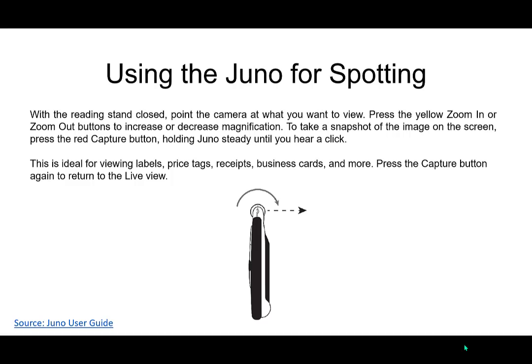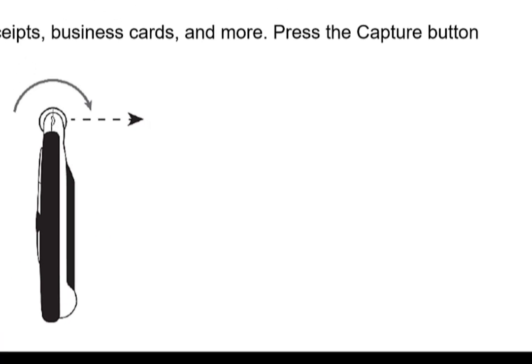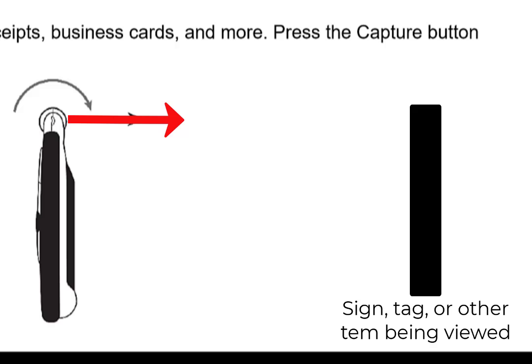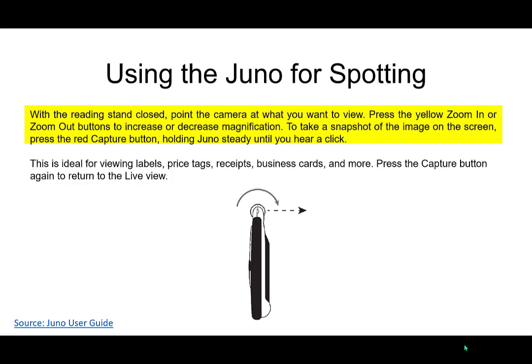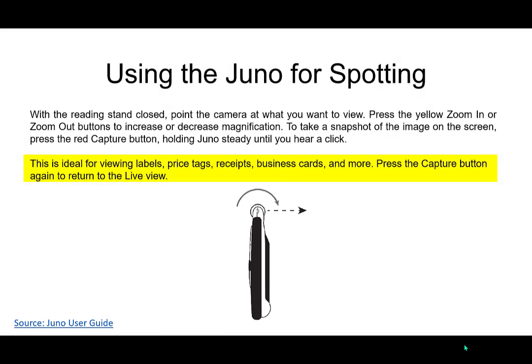The unit can also be used for spotting. And we call it spotting because we don't take the legs down. It's held in an upright position with the screen facing you. And you can use it to point the camera at things that you want to look at, zoom in and zoom out, do all of those things that you need, and hold it steady. You can use it to take a picture of something in this position as well, just like with the other positions. This is a good way of reading labels or tags where you can't put the tag actually underneath the unit, but you can position the unit so that you can read the tag. Things like on shelves if you're out shopping, or even signs that you can't see because they're too far away, things like that.